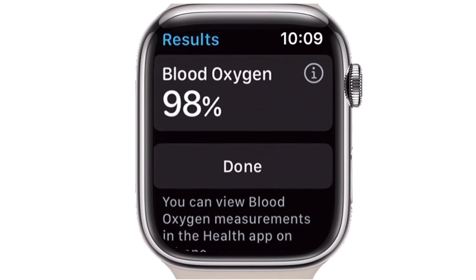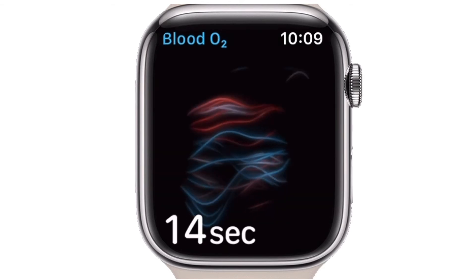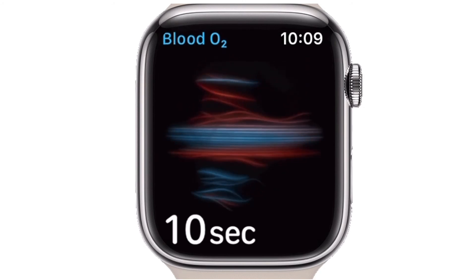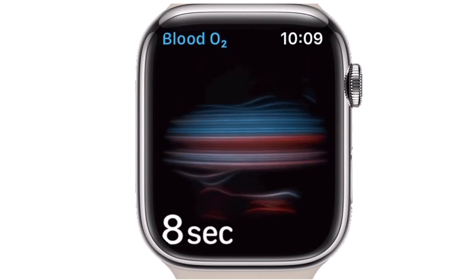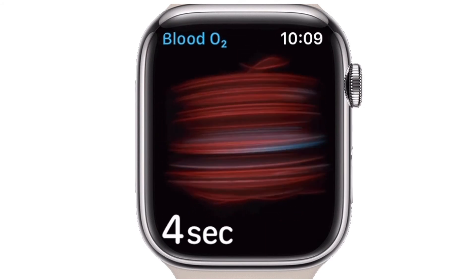Some users may fail to get a reading on their first attempt — you will see an unsuccessful measurement on the results screen once the countdown ends. This is probably because you moved your wrist or tapped your Apple Watch while taking the measurement. You can try again and stay still next time.